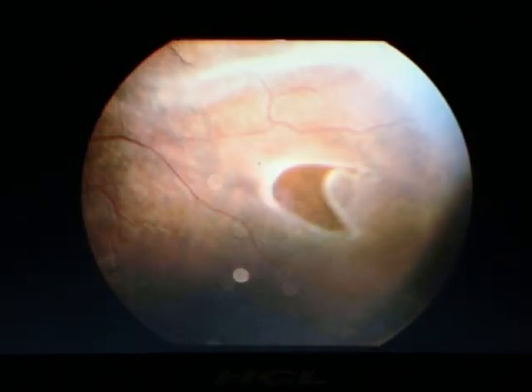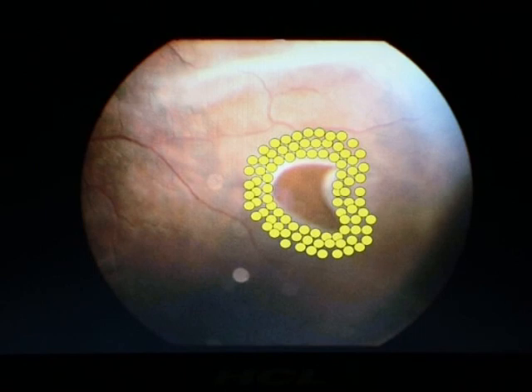Retinal breaks predisposing to retinal detachment need prophylactic treatment. Here, contiguous laser burns around the break in 2 to 3 rows are given, as vitreoretinal traction is thought to extend beyond the retinal break that is visible clinically.